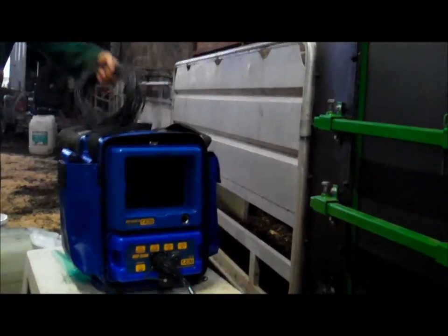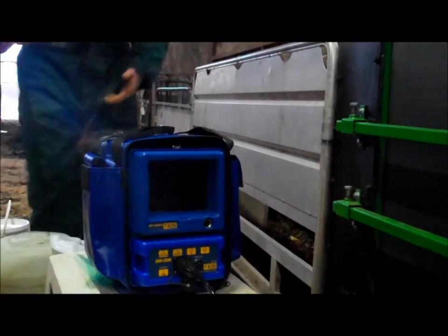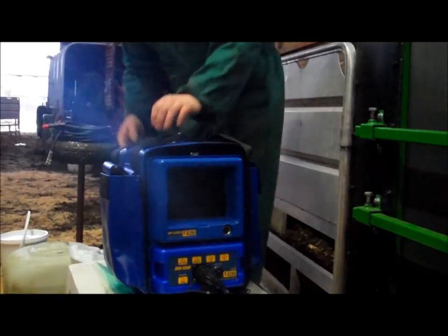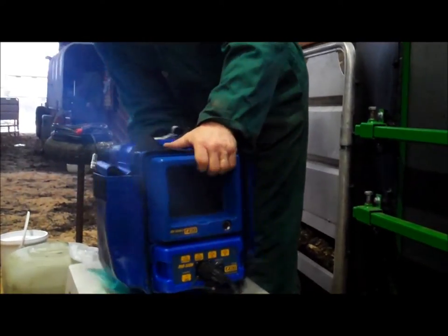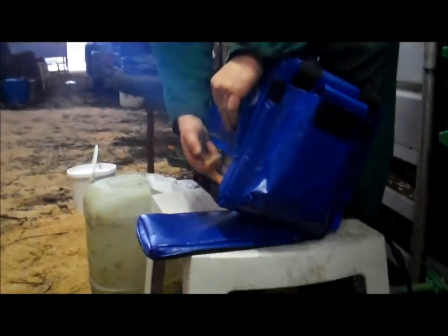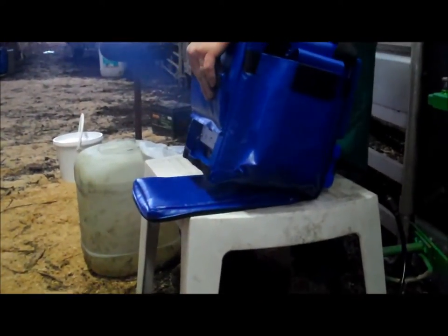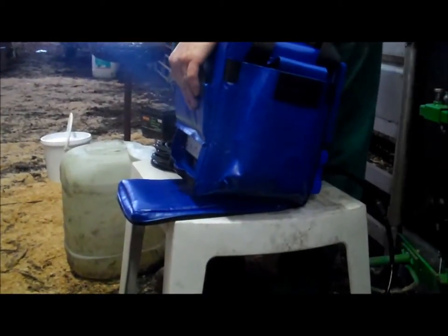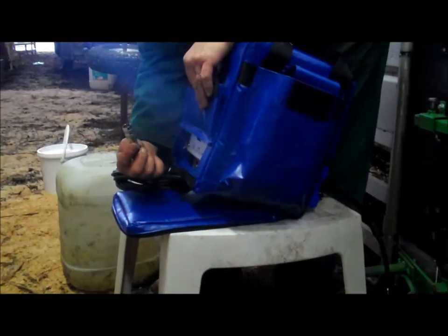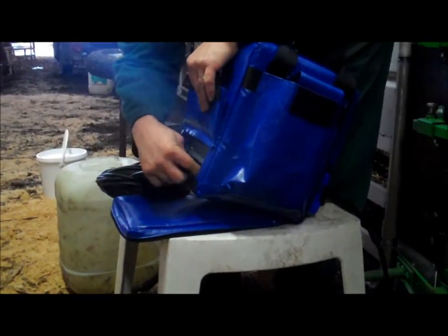The power comes in at the back of the machine. Your DC lead comes in here. Even if you're using mains power, it comes through a DC adapter first before it goes in. So it's the same connection — just a 2-pin socket into here and screw it home.